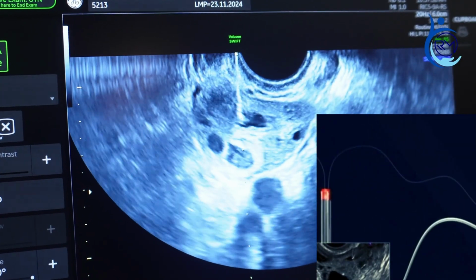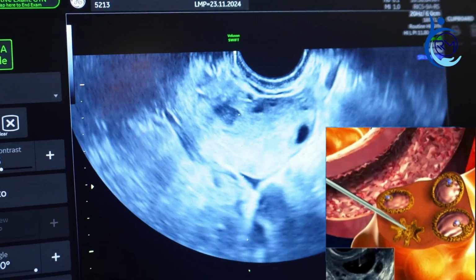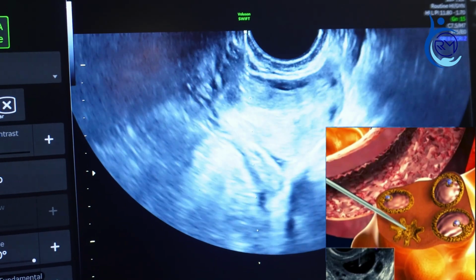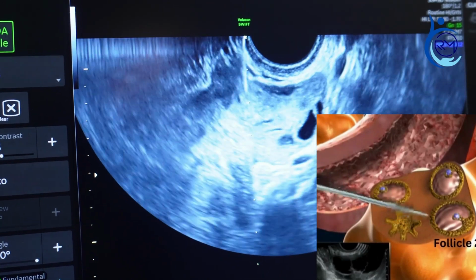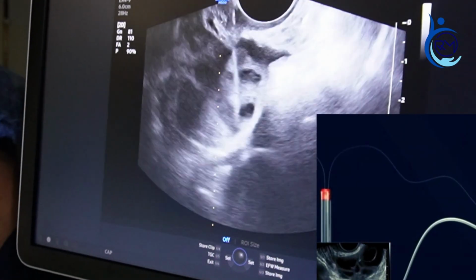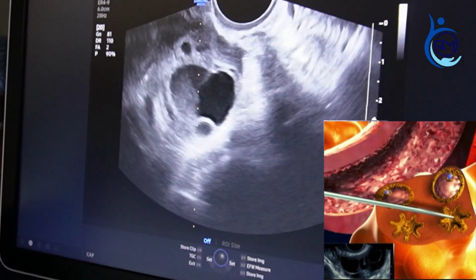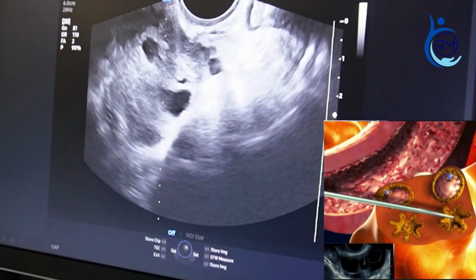The suction device must maintain a pressure of minus 100 to 140 mmHg. It is necessary to aspirate rapidly but not so much as to damage the follicle. A temperature of approximately 37 degrees needs to be maintained throughout this procedure. After collecting the follicular fluid from one follicle, the needle is passed to another follicle without damaging the ovarian cortex. Usually, the operator withdraws the needle a little, just outside of the ovarian cortex, then re-enters another follicle. The procedure continues until all the follicular fluid has been collected from each of the ovaries.